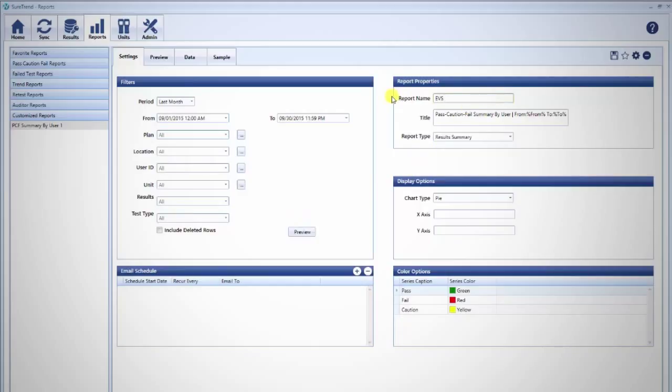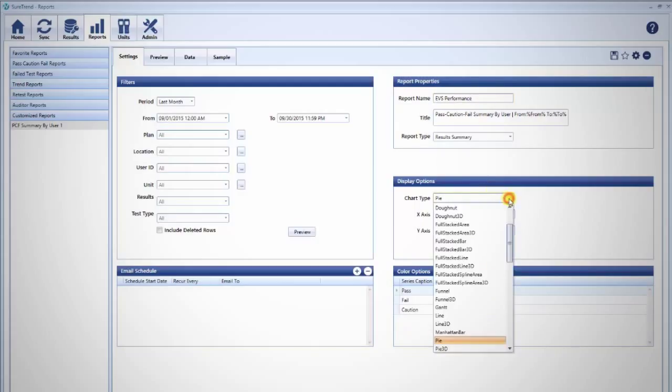Next, you may customize the report name and modify the chart title. The display options are preset to the most common chart type. However, if you have a different preference, you may change the chart type here.